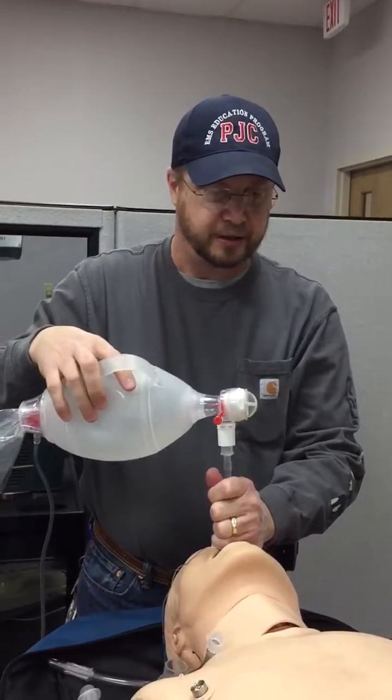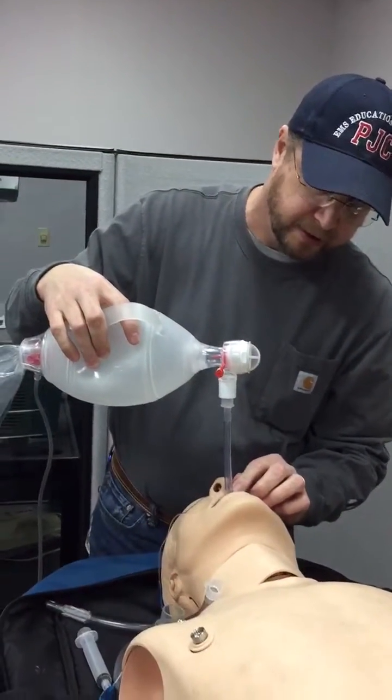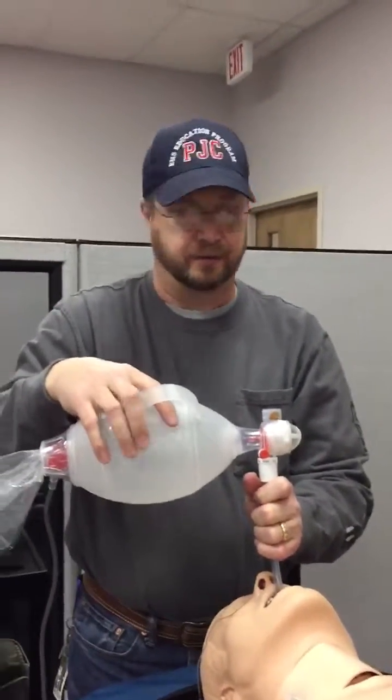We would also use other confirmation techniques such as end-tidal CO2, and then we would mark the depth of our tube and secure it in place with an ET tube securing device — a commercial device preferably.